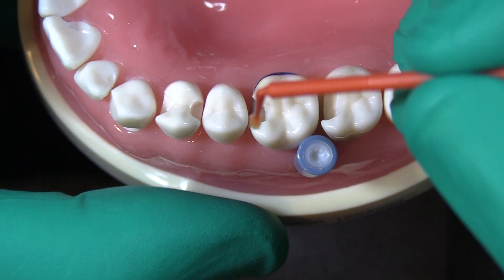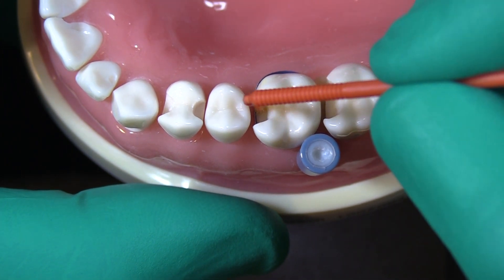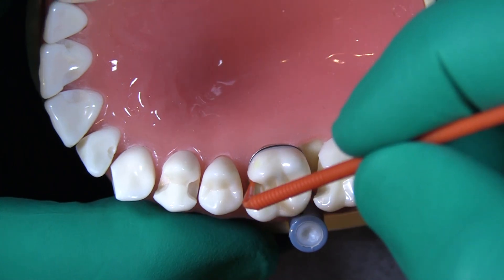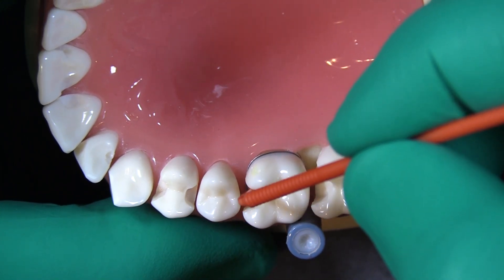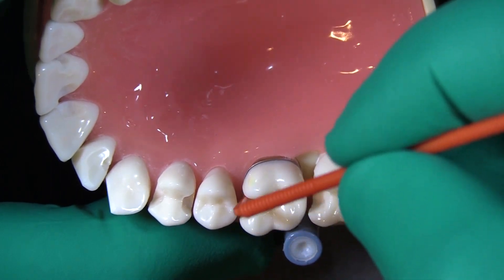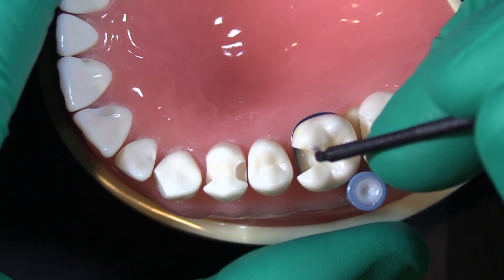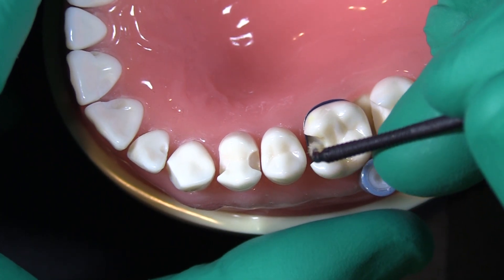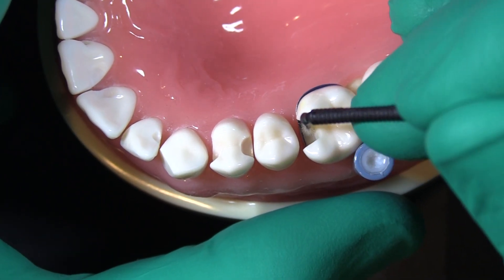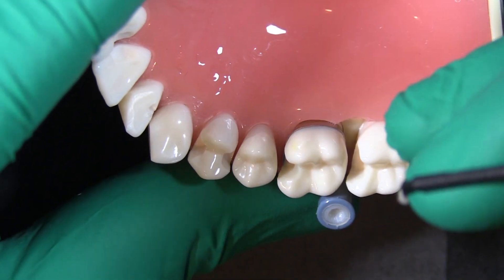With these micro brushes, we're going to scrub that down into the preparation and really cover all of our dentin surfaces — really scrub that in. Then what I like to do is take either a new micro brush and use that to blot up any excess. We don't want our bonding agent pooling in this area, as that would potentially cause some issues.